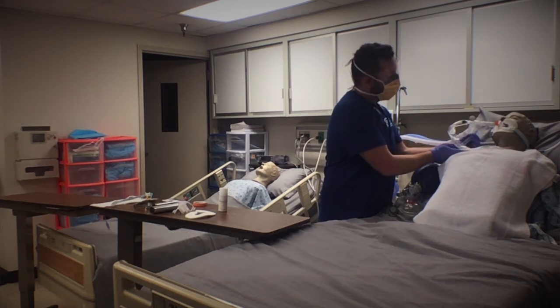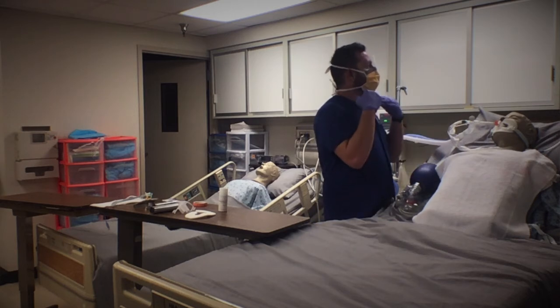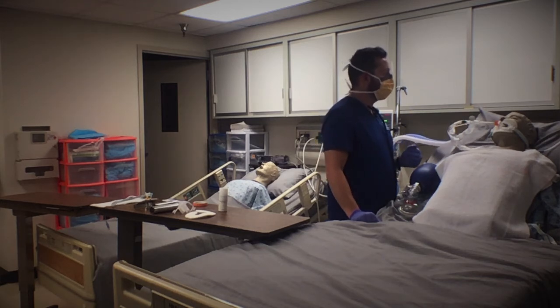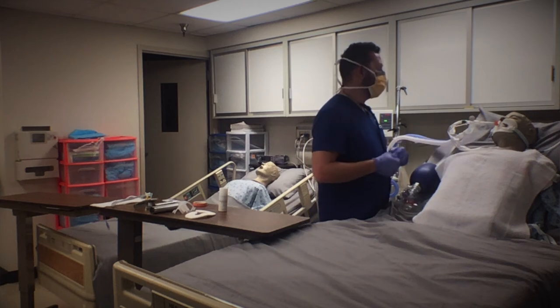I heard air around. So now what I'm going to do is talk to the patient, let them know what's happening. So today we have Mr. Daniel with us, and we're going to be pulling this tube out.